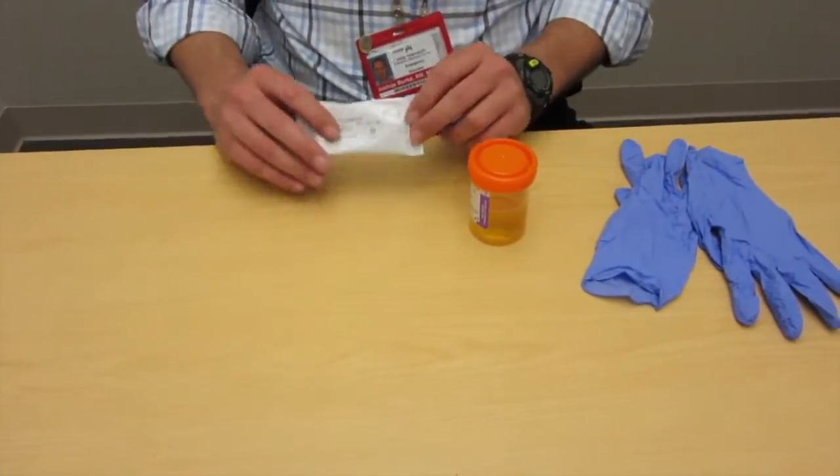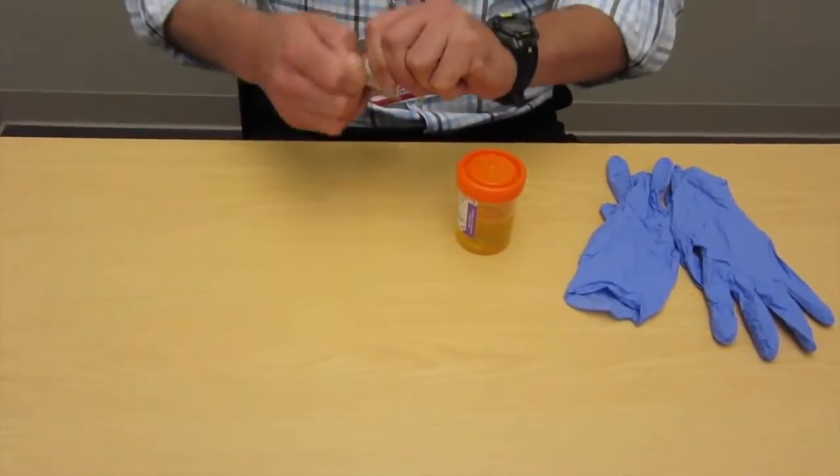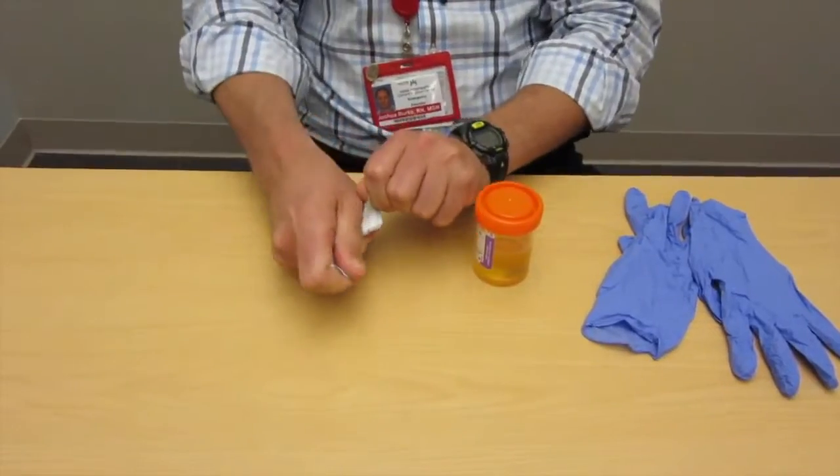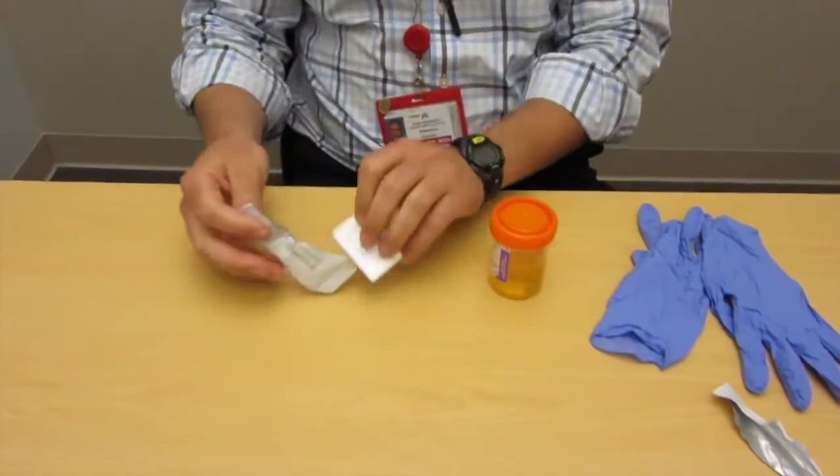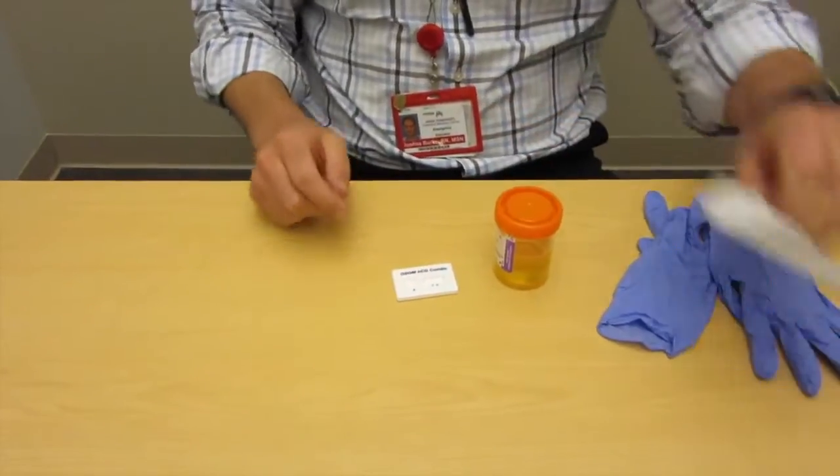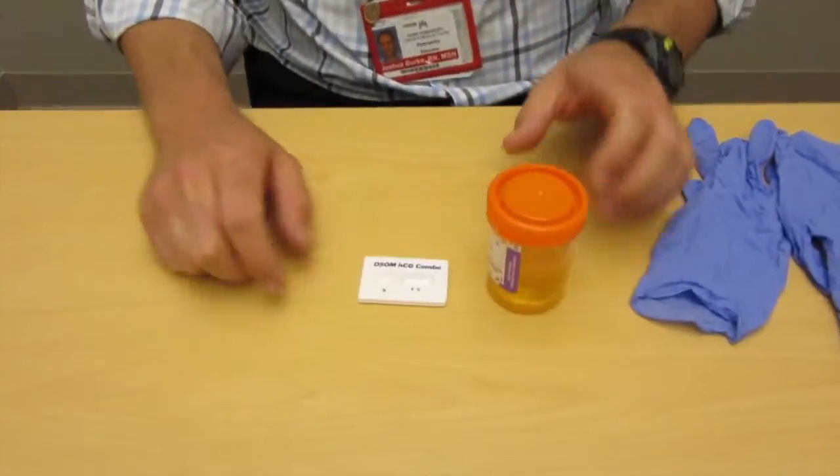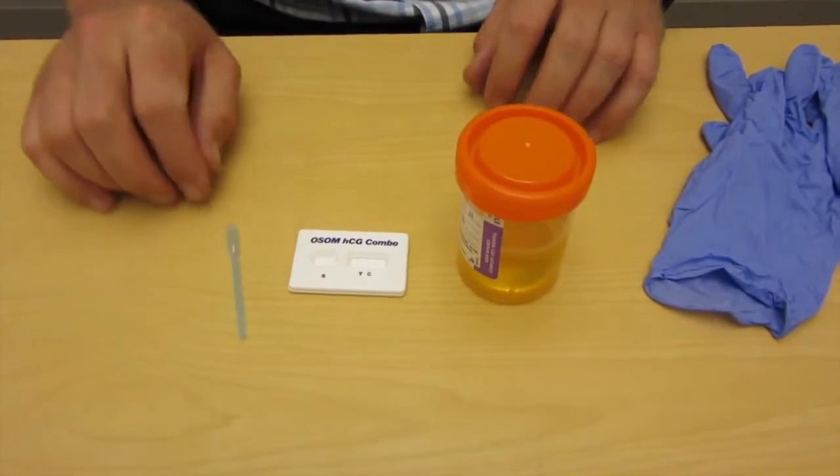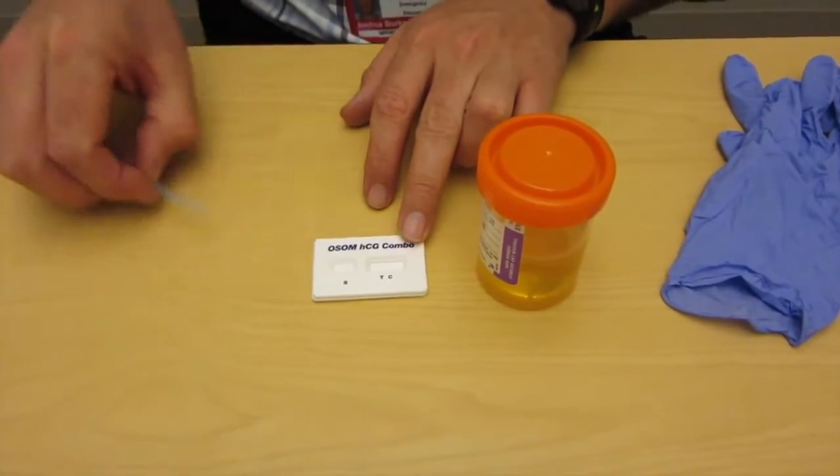Step two would be to actually use the urine pregnancy test kit to dip the urine. So you want to have an appropriate location for doing this. There are locations in the pods including by triage that actually have a chucks and an area to contain any kind of a spill.